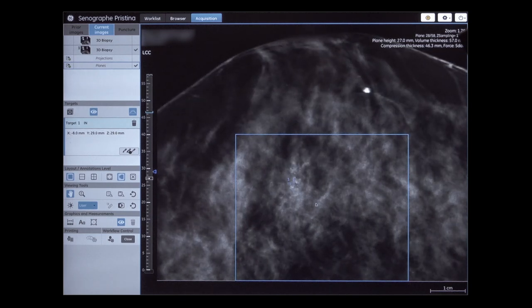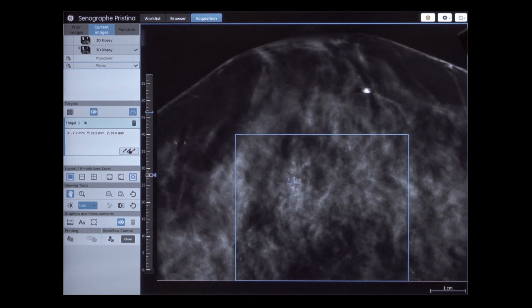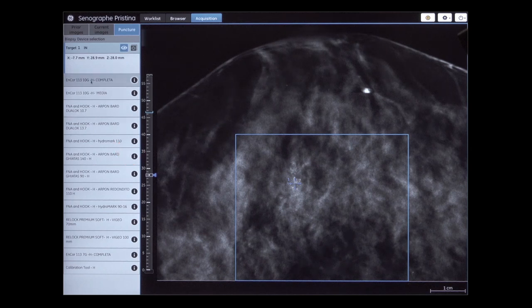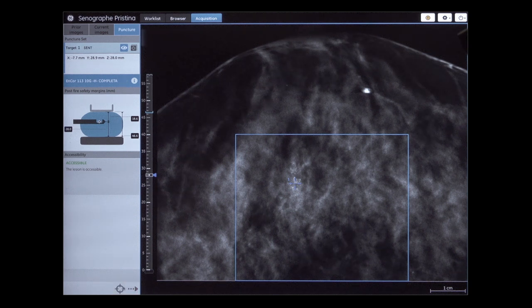Select the device needle to be used: Encore 113 mm 10G Horizontal Approach, Full Notch. Check the Lesion Coordinates and Safety Margins Diagram — this gives information about lesion accessibility. Send the lesion coordinates.